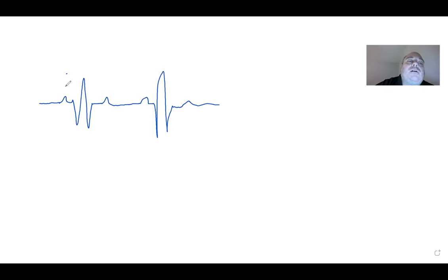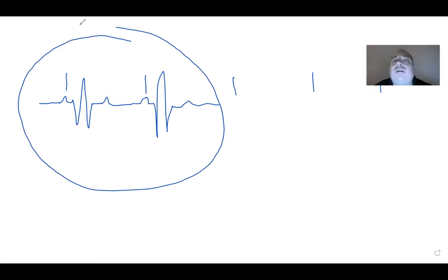You're going to want to march out from here on out like that, where you think the pattern should fall if it was following the same regularity or the same pattern, okay? So let's actually look at it. I just wanted to give you the explanation. If you're a little confused, it'll probably make more sense in two seconds. But I just wanted to introduce you to the concept of what I meant by marching out.